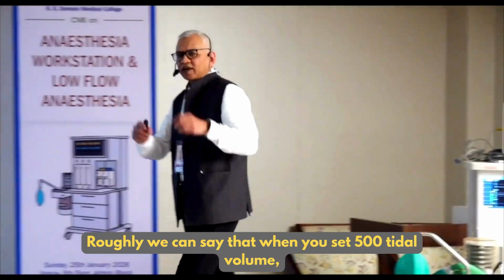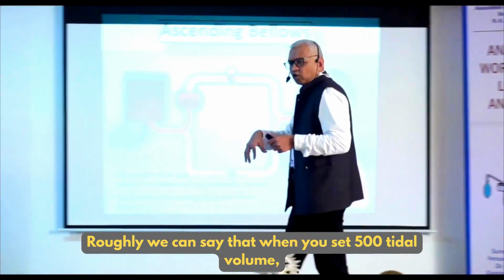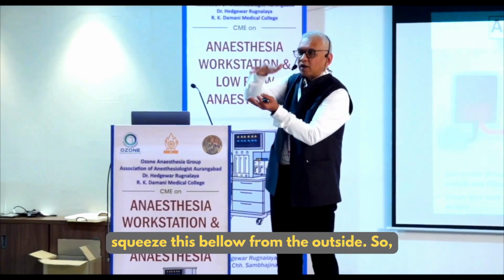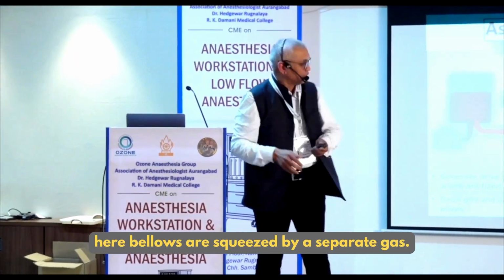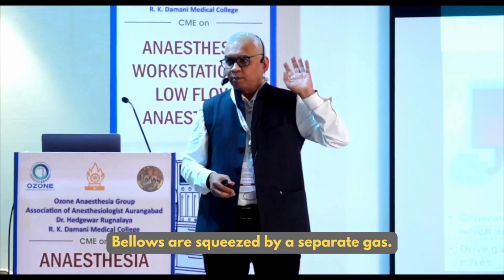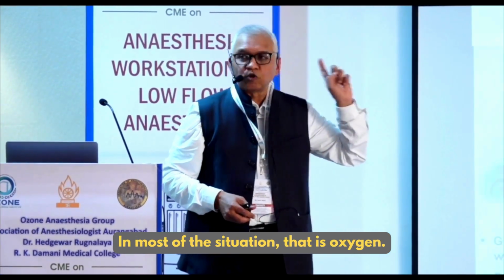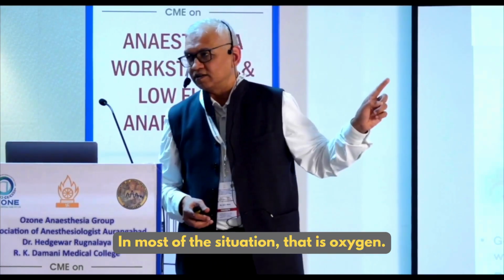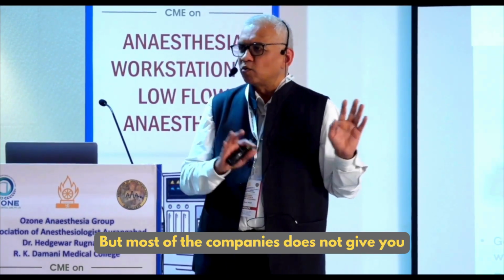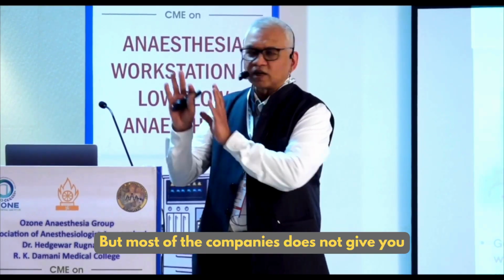Roughly we can say that when you set 500 tidal volume, 500 ml of separate gas comes and squeezes this bellow from the outside. In most situations, that is oxygen. Some machines give air as an option, but most companies do not give you that option.